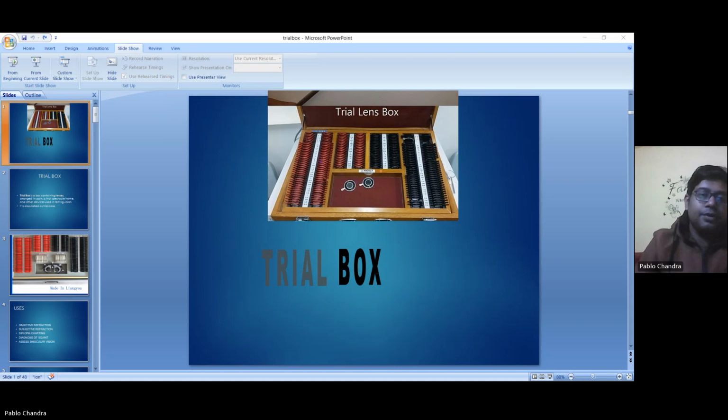For measurement and correction of angle of deviation, it is used in instruments like the gonioscope, keratometer, slit lamp, and applanation tonometer. So all these instruments can be used with prisms.